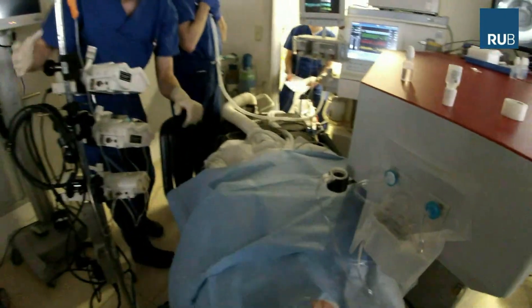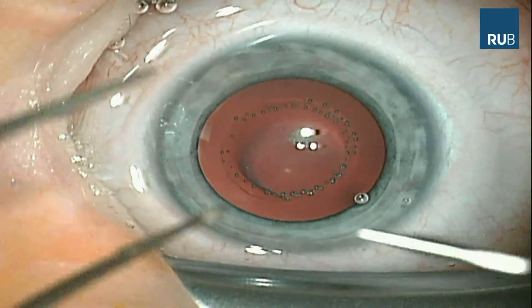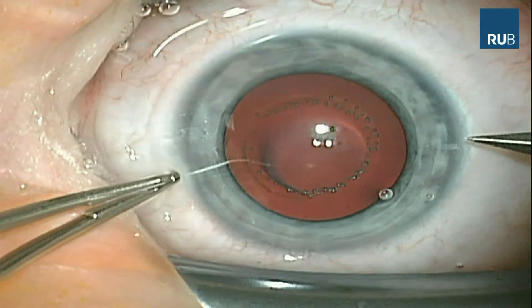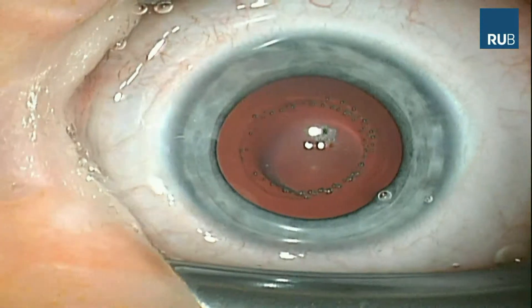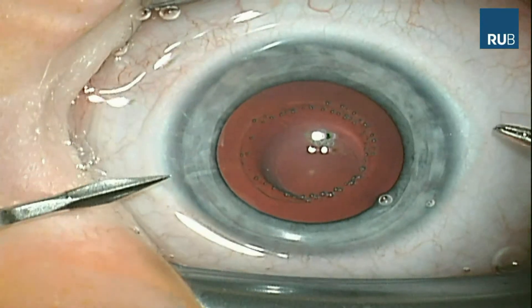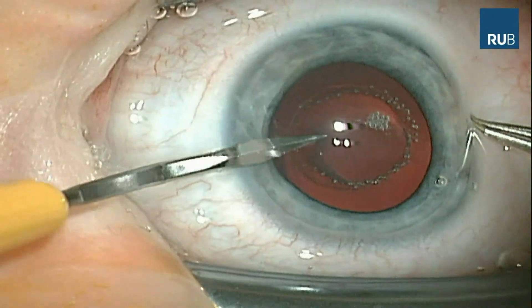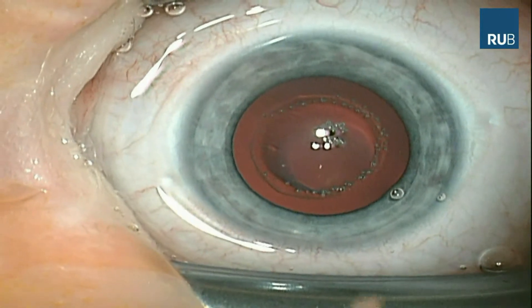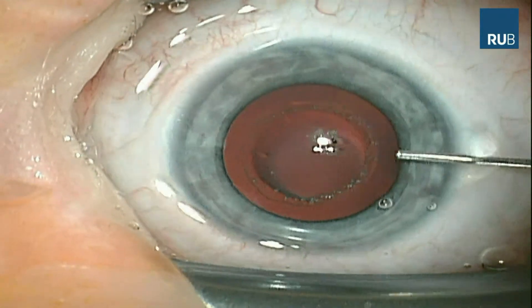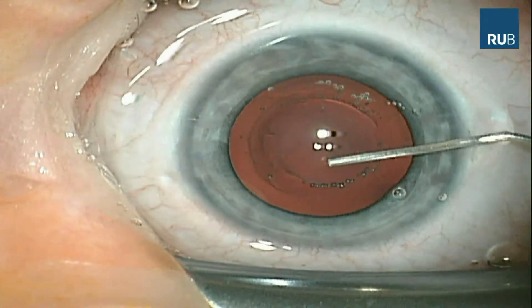After undocking from the laser, two paracenteses are made at 9 and 3 o'clock using the Blumenthal knife. A perfect capsulotomy can be seen. Notice the free floating capsule disc is resting in a slightly temporal and superior position. After filling the AC with OVD, the free floating capsulotomy is taken out with a micro forceps for further histopathological and dimensional evaluations.